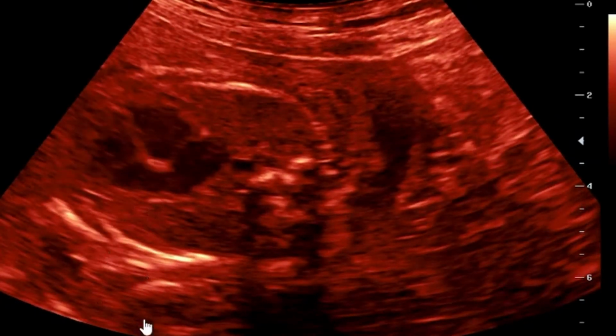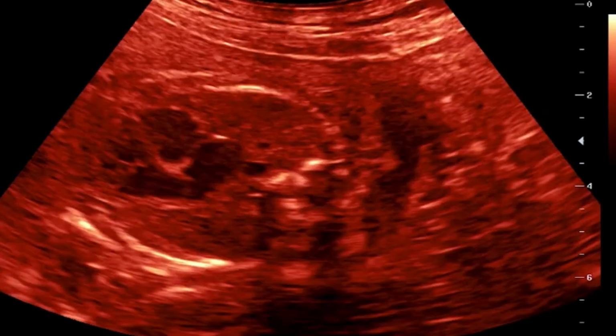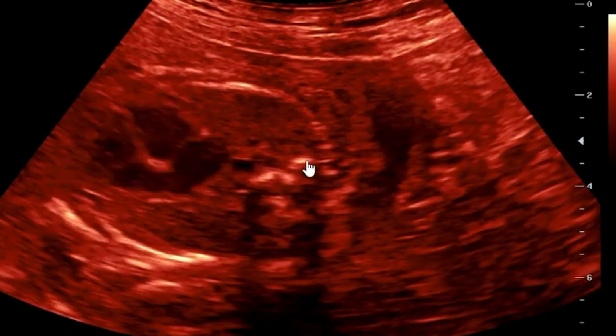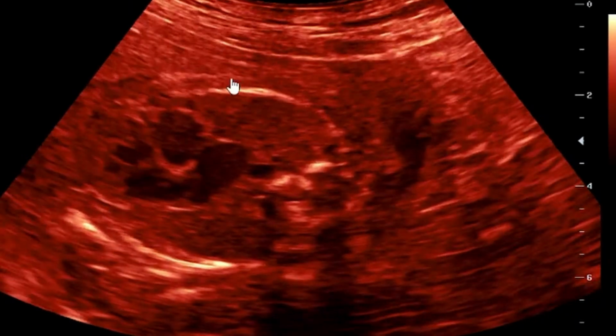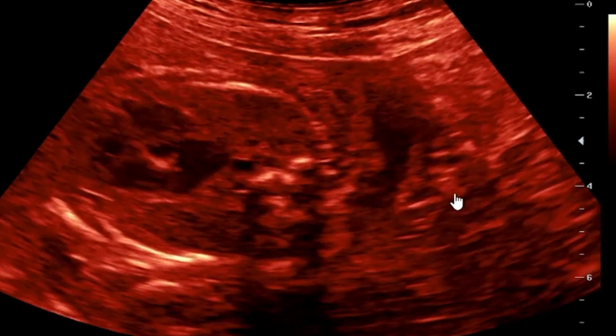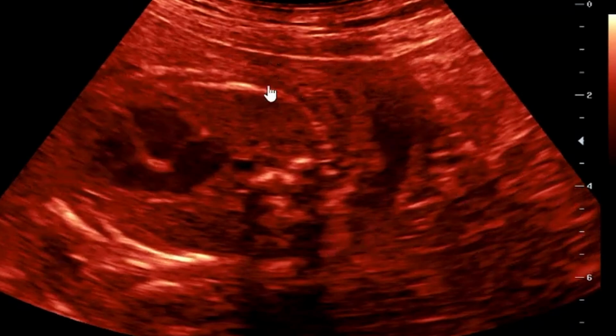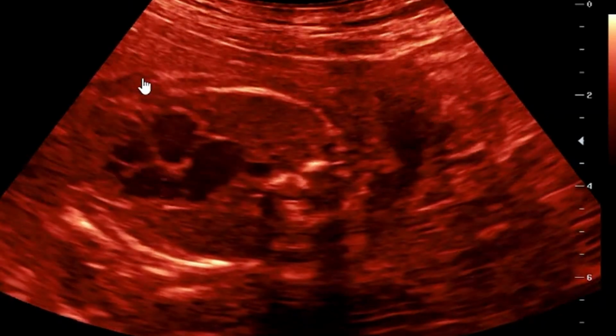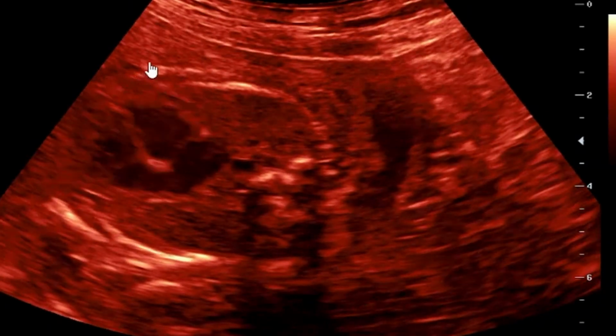So when you're doing an ultrasound scan, it needs one with an eagle's eye to check everything at a glance or at once. So you do not have to rush those scans. Check for these obvious abnormalities. They are easy to miss as well when you're doing an ultrasound scan, because from this end you can actually see that the patient also had oligohydramnios. So it needs one to have a meticulous eye to actually see that the heart is beating outside the thoracic cavity.